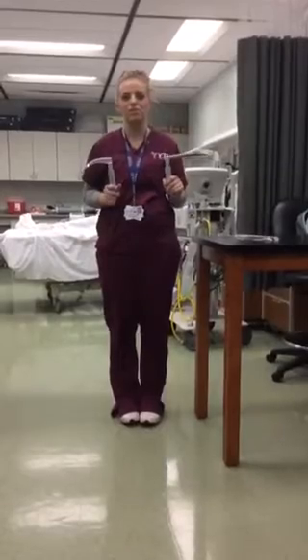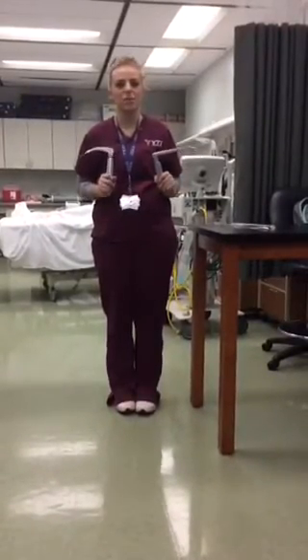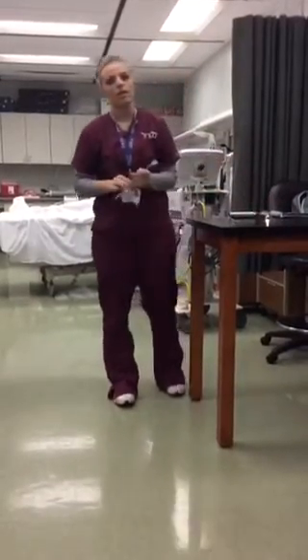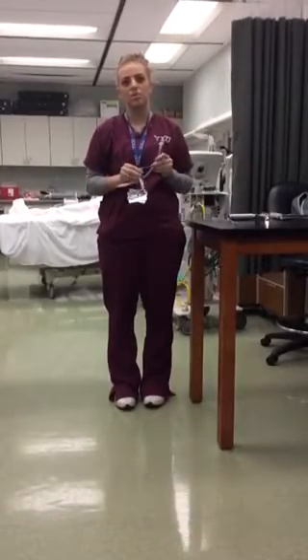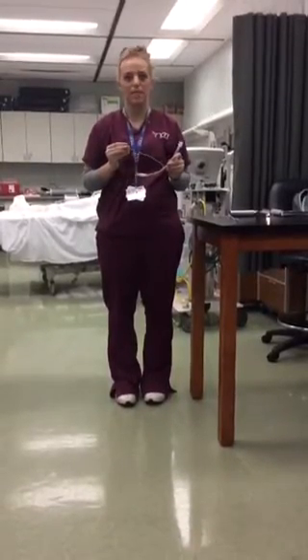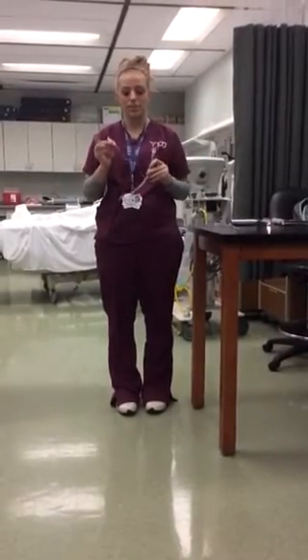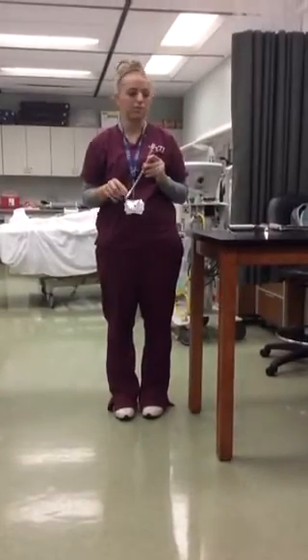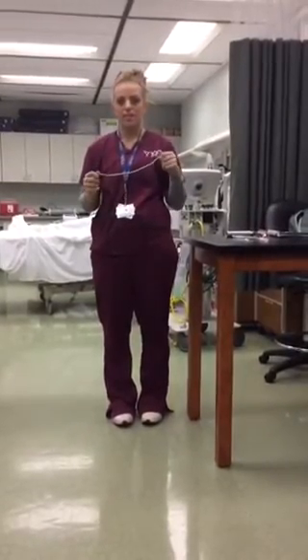We have two different types of laryngoscope. First is a straight blade known as a Miller. Second is a curved blade known as a Macintosh. Next we have an ET tube known as an endotracheal tube, a small, usually plastic tube inserted into the trachea through the mouth to maintain an unobstructed passageway, especially to deliver oxygen to the lungs. This is the cuff, which inflates or deflates the balloon at the bottom of the ET tube.